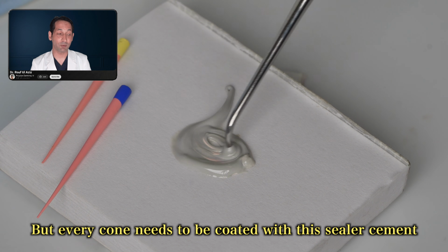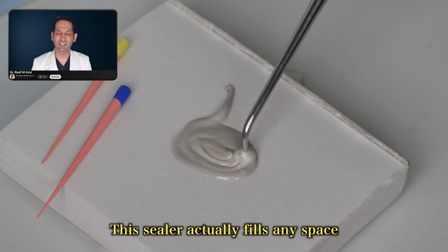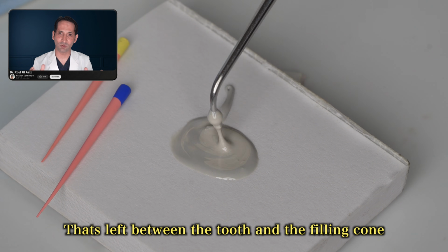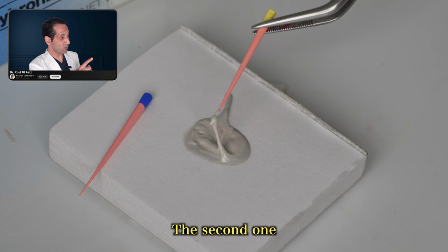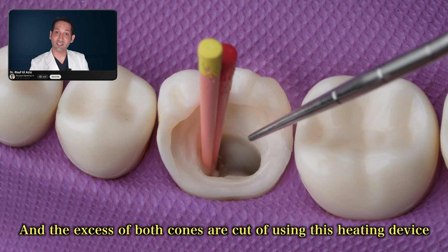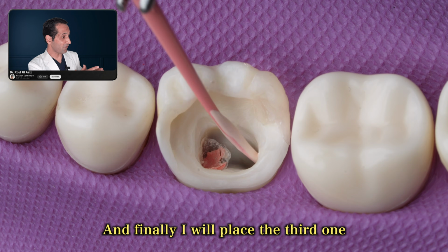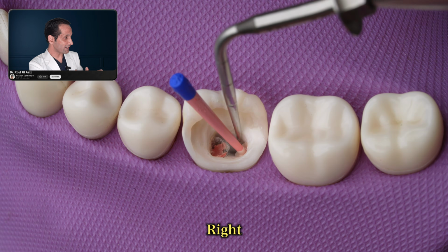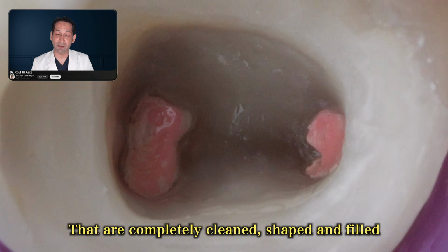But every cone needs to be coated with the sealer cement. The cement actually fills any space that's left between the tooth and the filling cone. Here it is. I'm placing the first cone with the sealer, then the second one, and the excess of both cones is cut off using this heating device. And finally I will place the third one. Right. Now we have the roots of the tooth completely cleaned, shaped and filled.